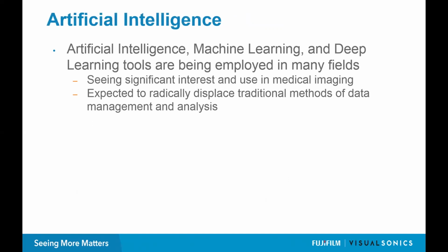and that the AutoLV tool is an artificial intelligence-based tool. This is just a couple things that I wanted to mention about artificial intelligence. These terms, artificial intelligence, machine learning, and deep learning, are certainly terms that are in the forefront of technology discussions these days. And these tools are being employed in many different areas.